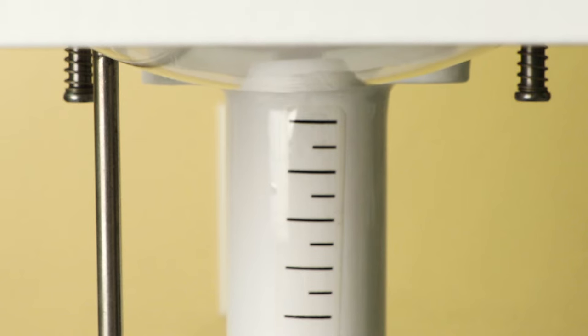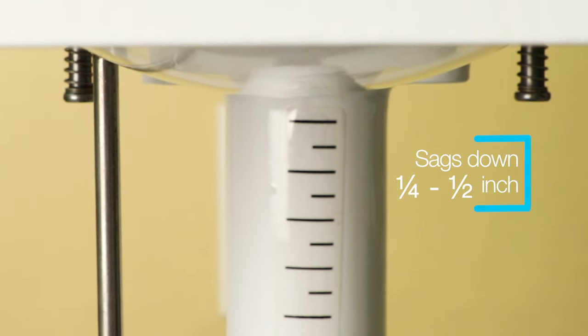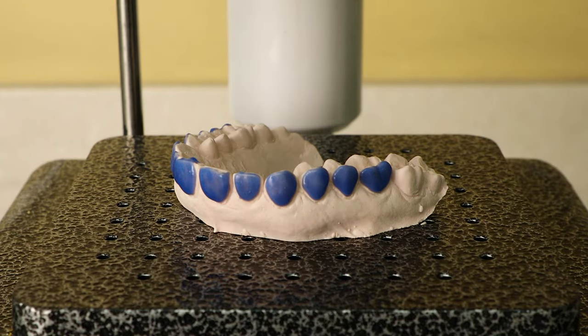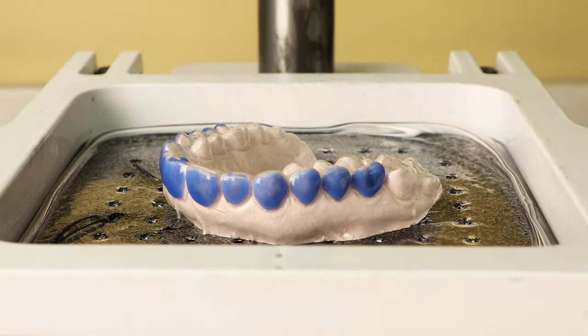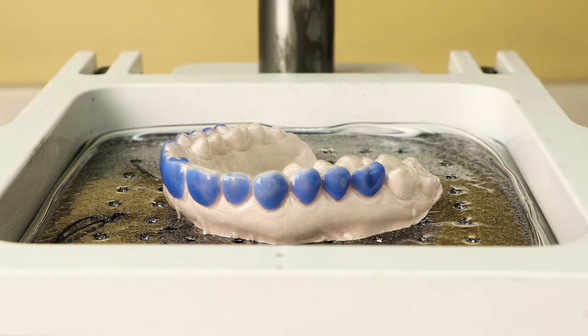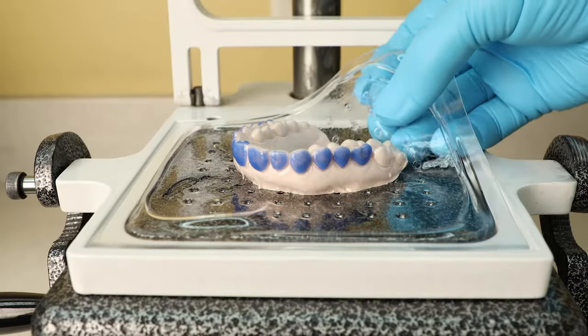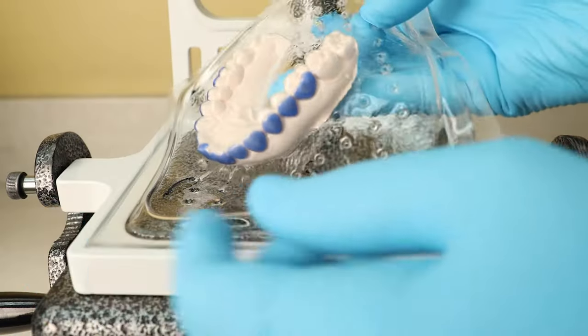With vacuum former, heat the tray material until it sags down approximately one quarter to one half inch. Activate the vacuum and adapt the softened plastic onto the model. To avoid distortion, cool the tray material completely before removing from the model.